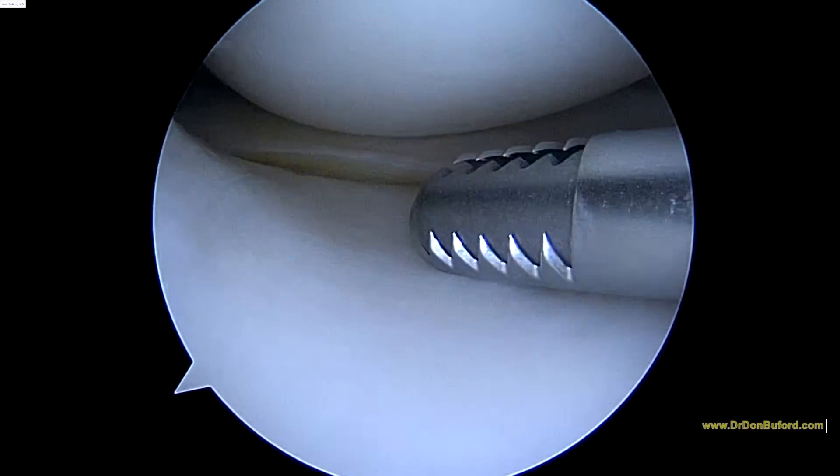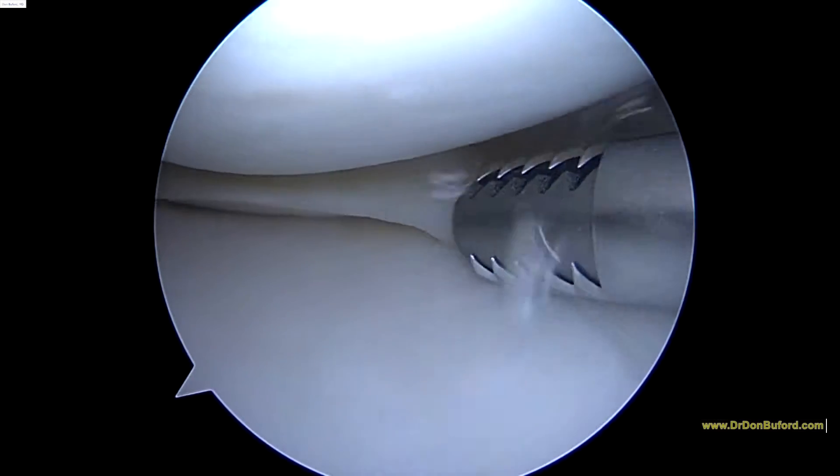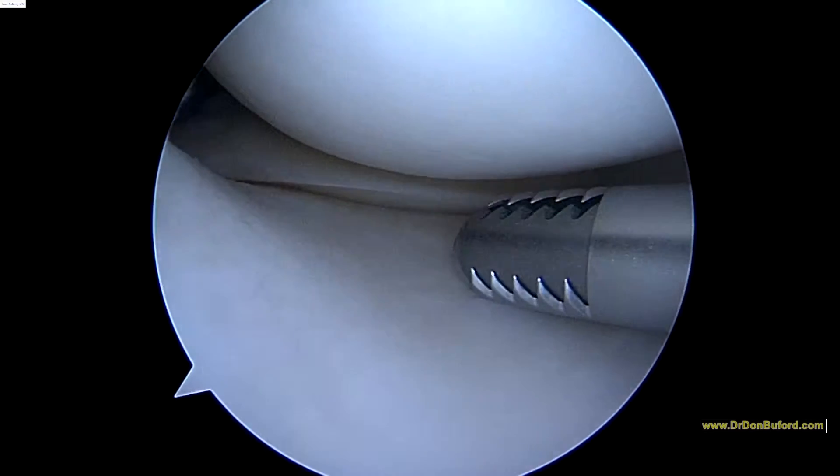Hi David, it's Dr. Buford. I'm here for us, the knee team. We're just getting started on the right knee. We've already harvested some bone marrow aspirate, and we're going to concentrate that as we're going through the knee.